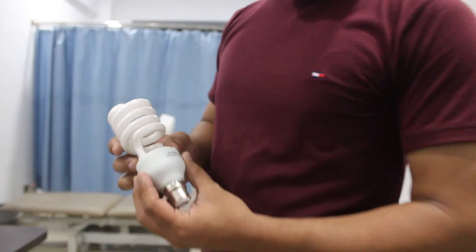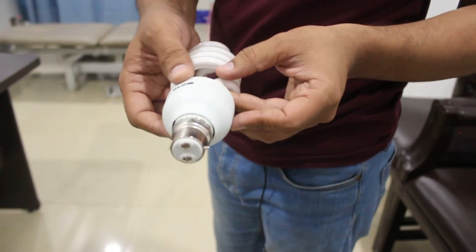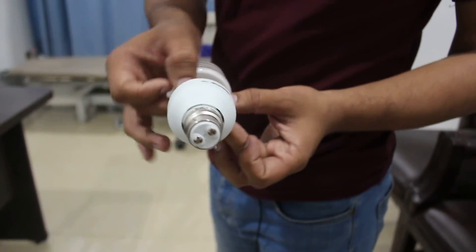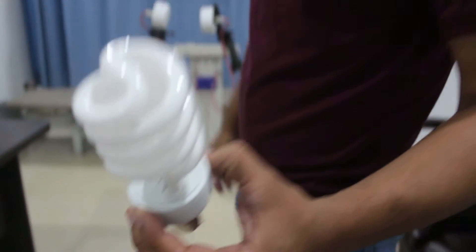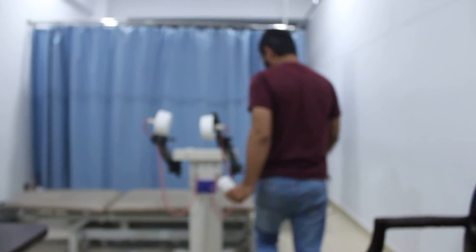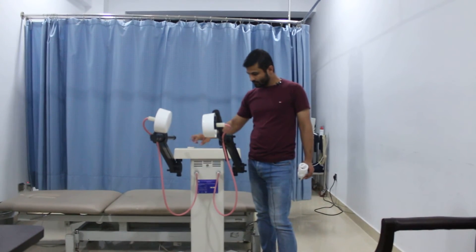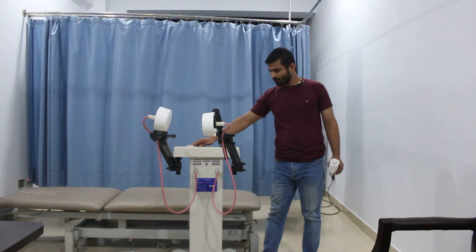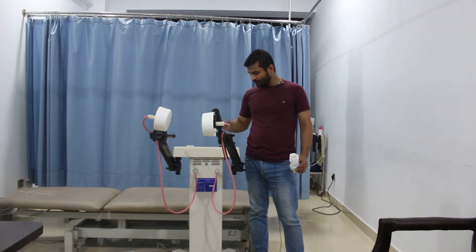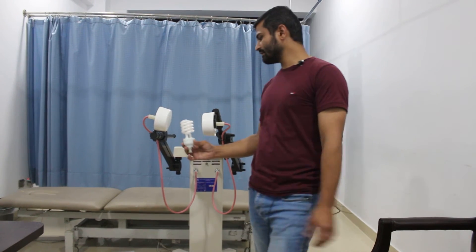It's a standard bulb — it has no switch, no button, nothing else. There is nothing attached to it. When I turn on the output of this unit — the unit is now working and showing treatment — if I place this bulb over here, you will see it glow.